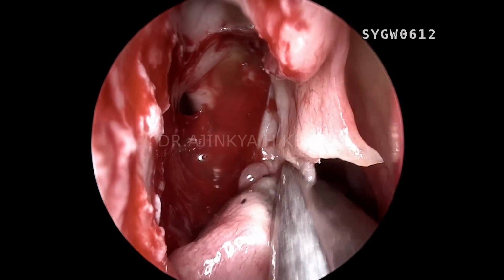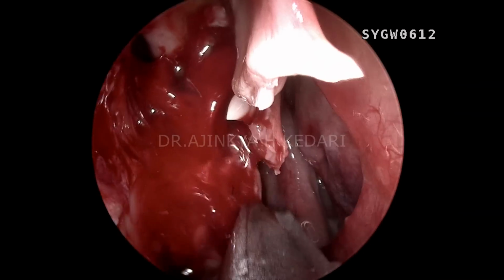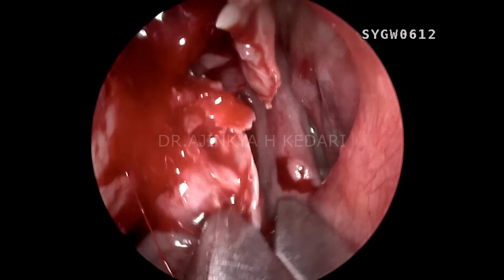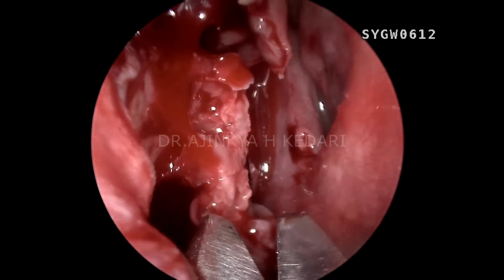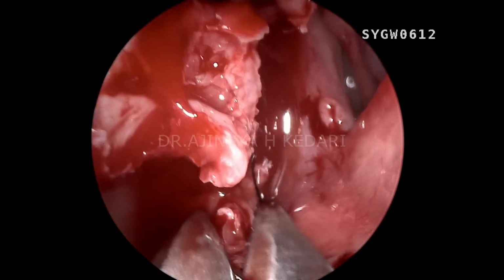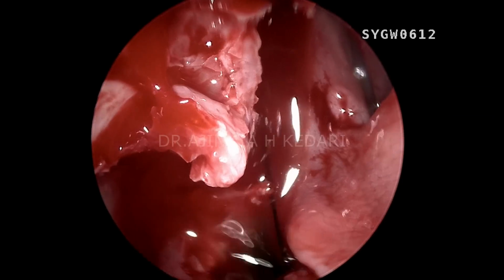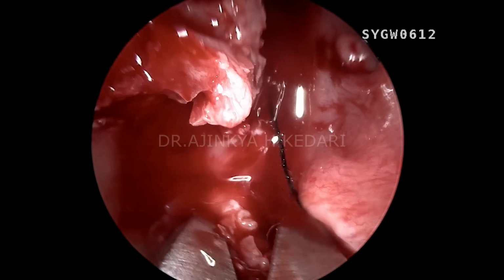So what I'm doing now is, it's time for me to take away the lower 2/3 of the middle turbinate, so as to have some extra space to work inside. Now, once I have taken off the middle turbinate, make sure that as you go posteriorly, you do not injure the stump of the middle turbinate near its posterior attachment.